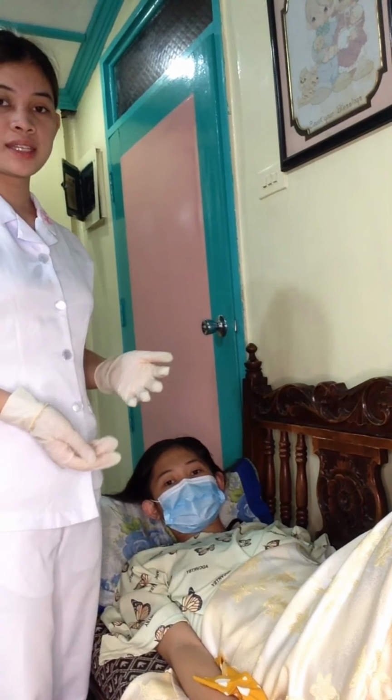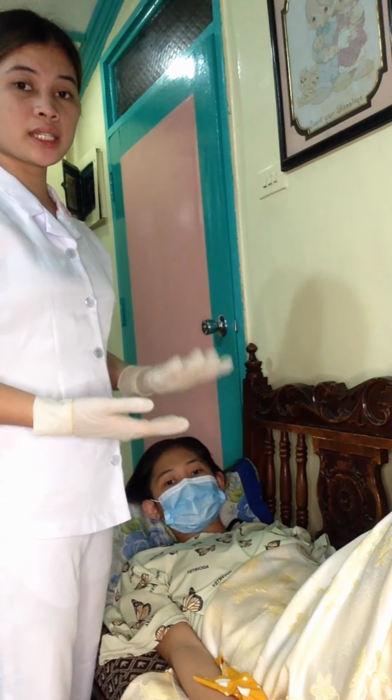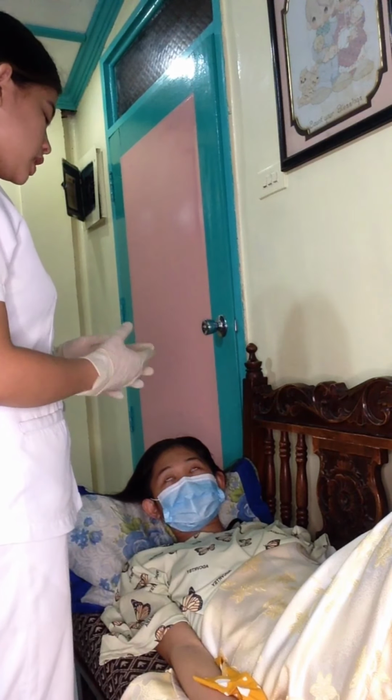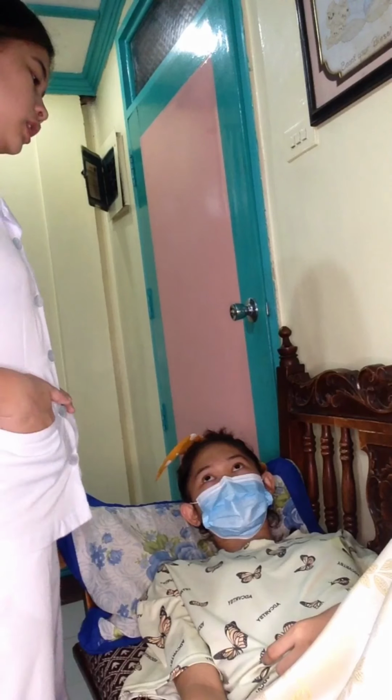So next is identify the patient and explain the procedure. This is to ensure that the procedure is given to the correct patient and also to gain patient cooperation. So hello ma'am, good day. I'm Patricia Antiga Silga from Davao Doctors College and I will be your student nurse for today. May I know your name, ma'am?